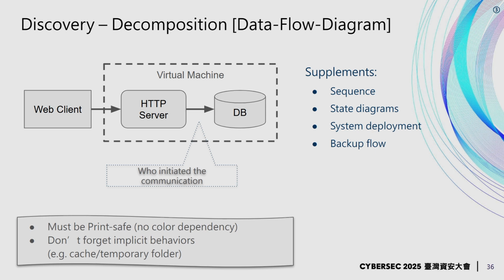Then there's other types of visualization that can be helpful for threat modeling. Some of them are even mandated by the FDA. I will not go through them in detail, but they include how you're going to manage your software later, how you're going to do backup, how you're going to update them, and so on.